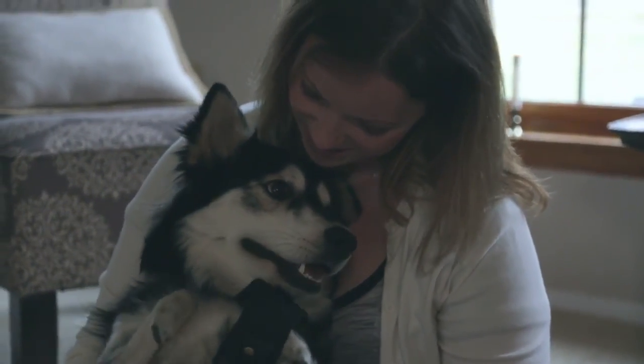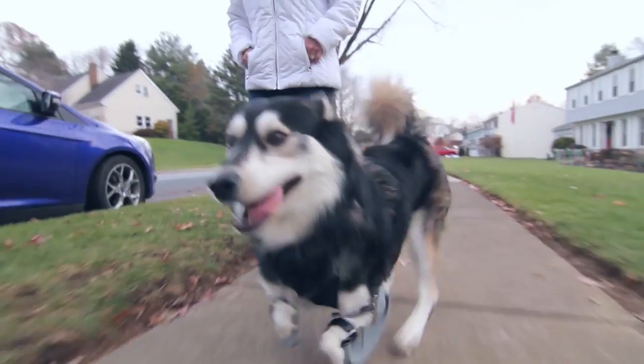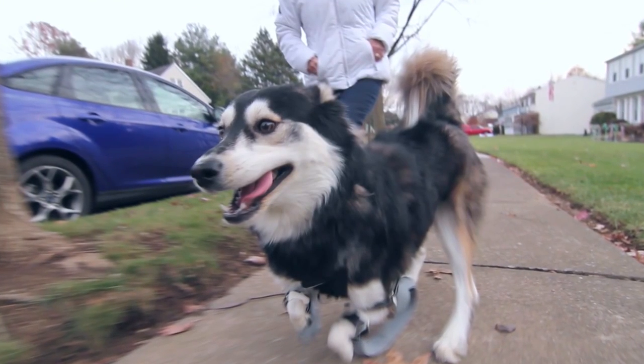This is what 3D printing is all about. To be able to help anybody — dog, person, whoever — to have a better life is just... there's no better thing to be involved in.